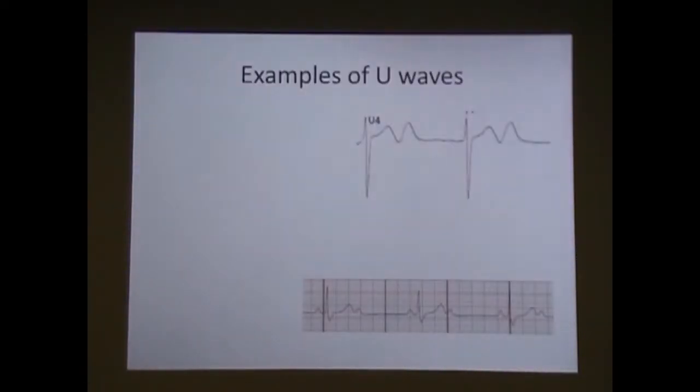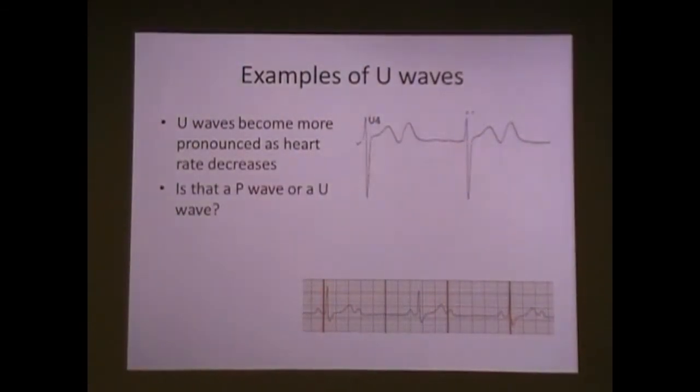I was trying to figure out why. Examples of U waves. So as I said, it becomes more pronounced as the heart rate decreases.